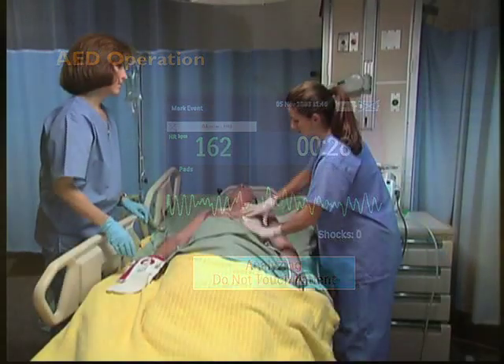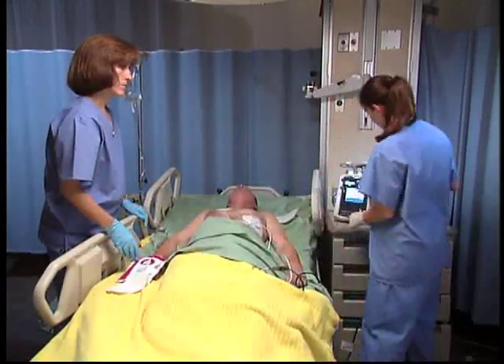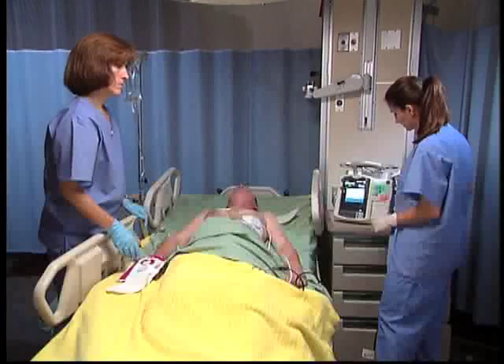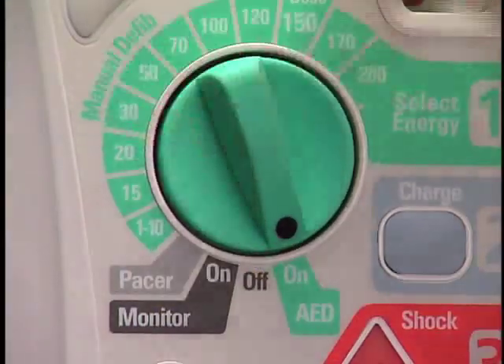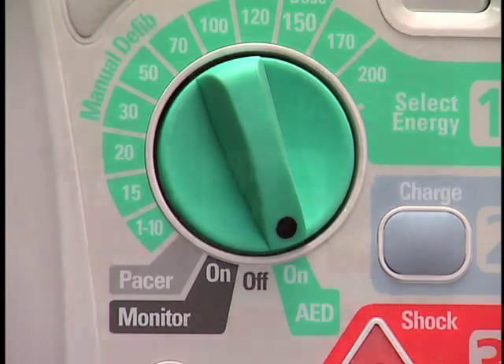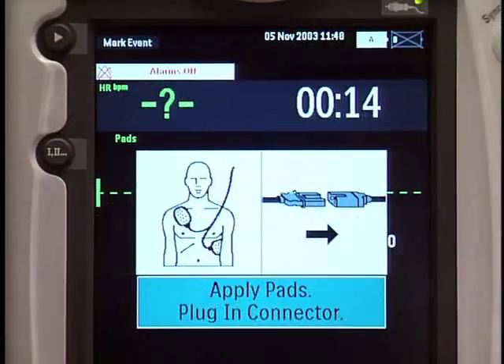When operating in AED mode, the capabilities of the MRX are restricted to those essential to performing semi-automatic external defibrillation. You turn the therapy knob to AED and the MRX advises you to connect the pads cable, apply pads to the patient's bare chest, and plug in the pads connector.